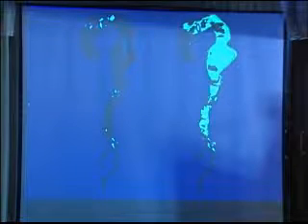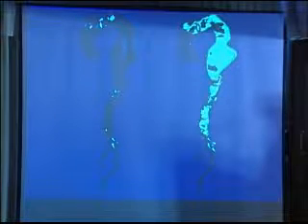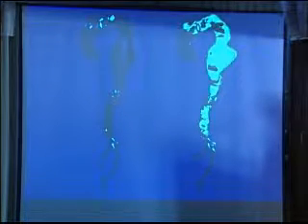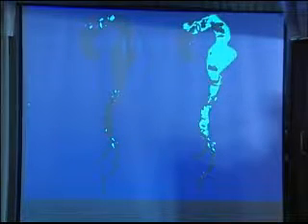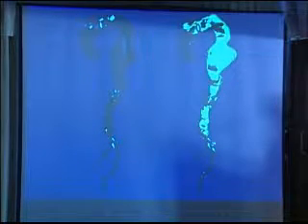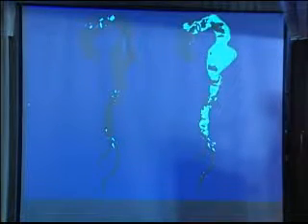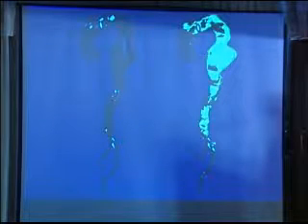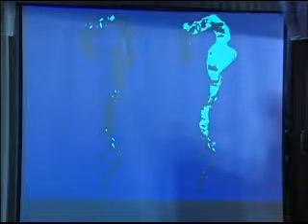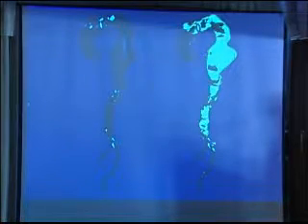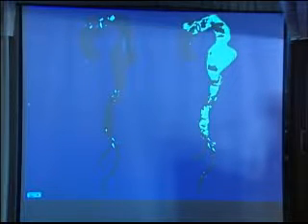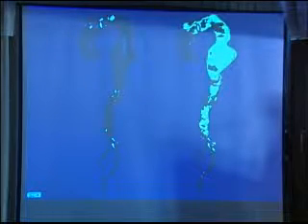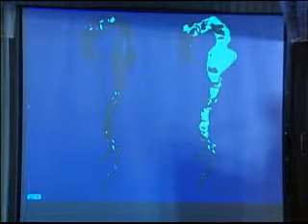We talked about atherosclerosis of the aorta. This is a little software we play with — all the aortic surgeons know about it. It's called M2S software, which has the capability of showing you the inside of the aorta. It can take all the plaques away, just like this one, and show you the red blood.